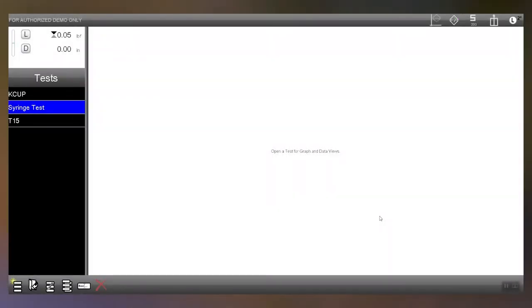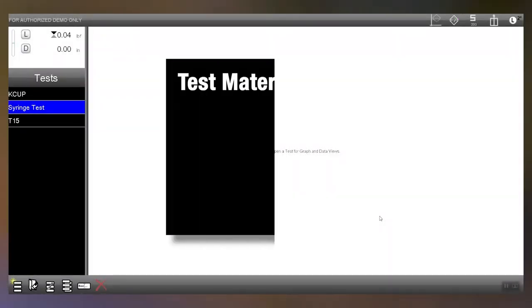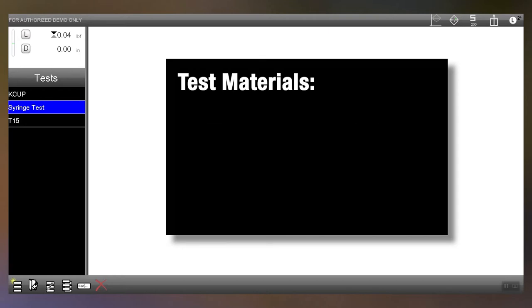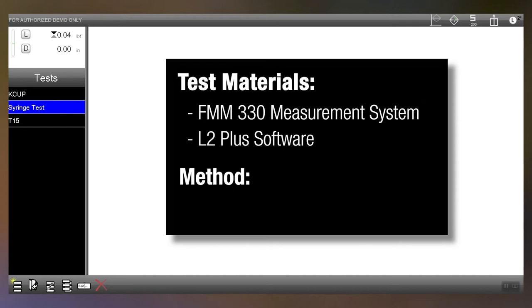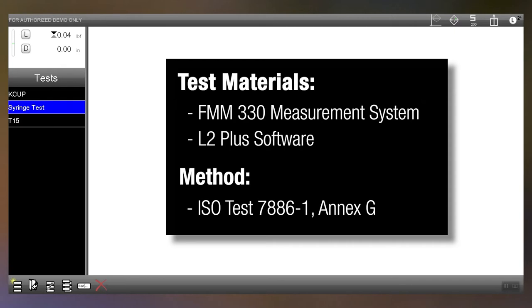Okay for this particular test we're going to be using the following. We're going to be using an FMM 330 with L2 plus and the test we're going to set up for is an ISO test 7886-1 and we're going to use Annex G.